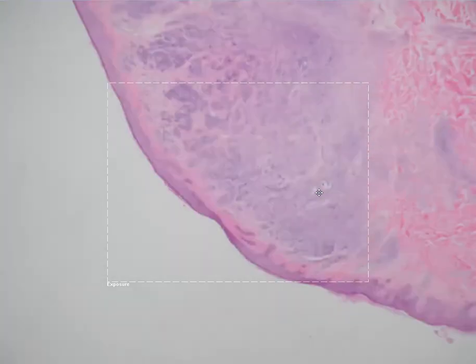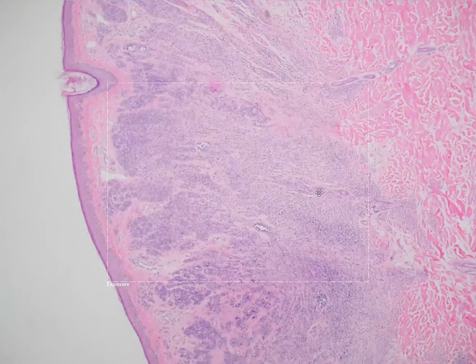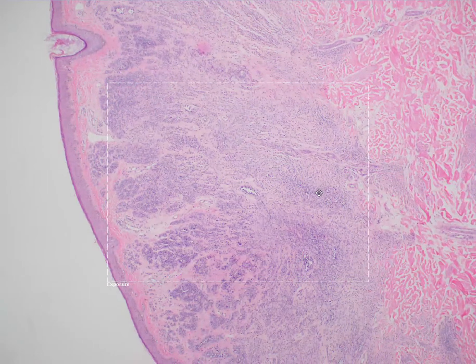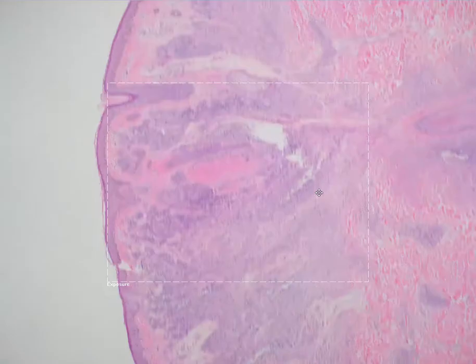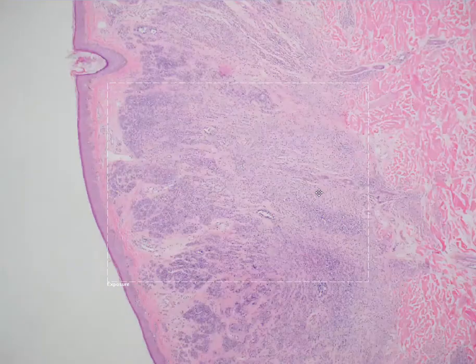Today I'm going to be discussing my approach to evaluating melanocytic proliferations under the microscope. We have epidermal or junctional nevi situated primarily in the epidermis, dermal nevi situated primarily in the dermis, and nevi with components in both the epidermis and dermis, which we refer to as compound nevi. Most of my description will revolve around dysplastic nevi.